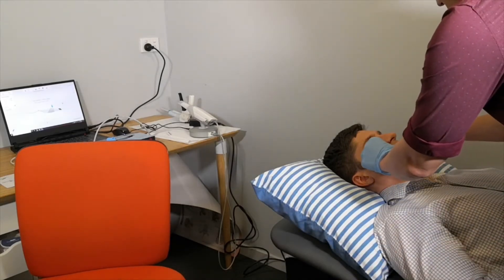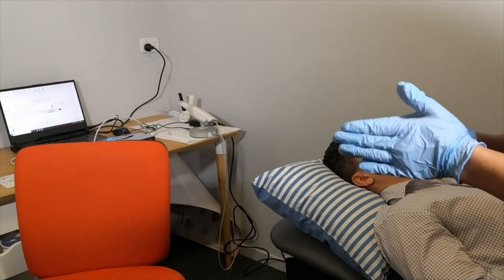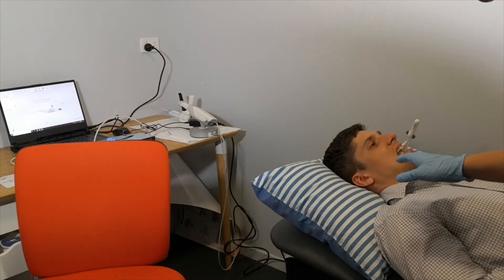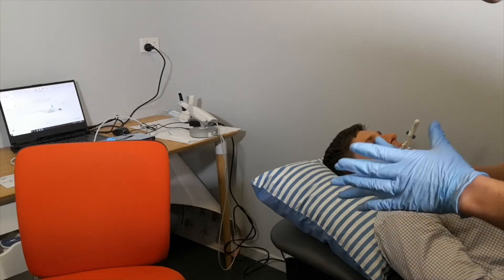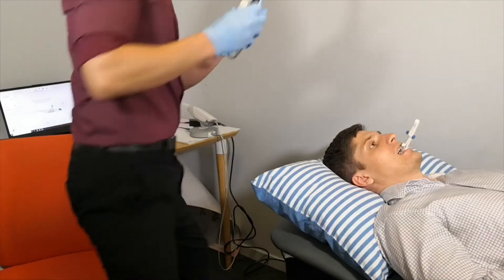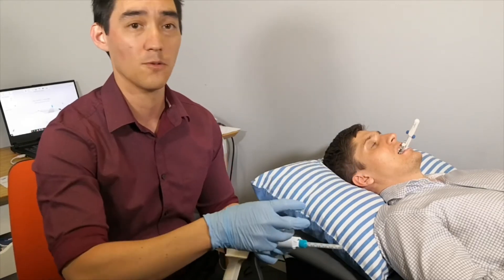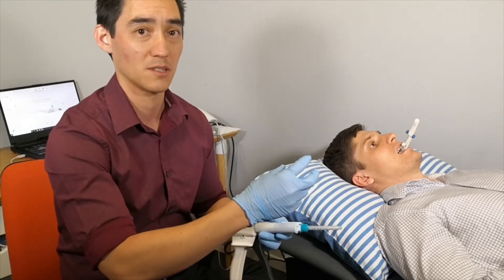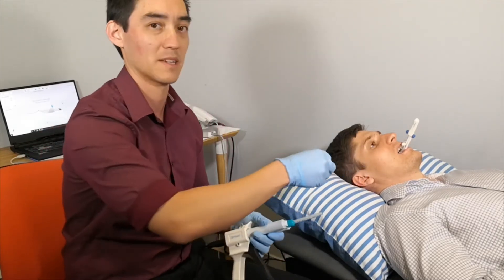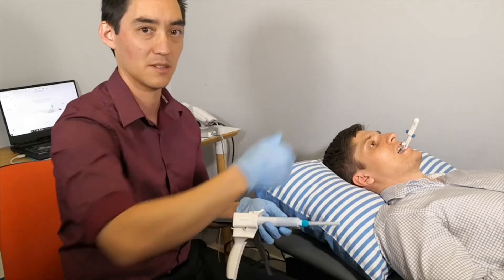Just keep biting and I'm going to lift the upper lip and then lift the lower lip, and just make sure that as close as possible to that patient's midline as determined first. Now we want to take the record. We do want to use some bite registration even for scanning — we could scan like this, but the patient sometimes will move their jaw, so it's nice to get them more locked in that position. There are two ways of doing this. The first way is we could take the gauge out, put bite registration along the whole fork top and bottom, put it back in, get them to bite into it, let it set, take it out, and then use a scalpel to cut off the sides, put it back in, and scan the quadrant one and quadrant four molars on each side as the second bite registration.